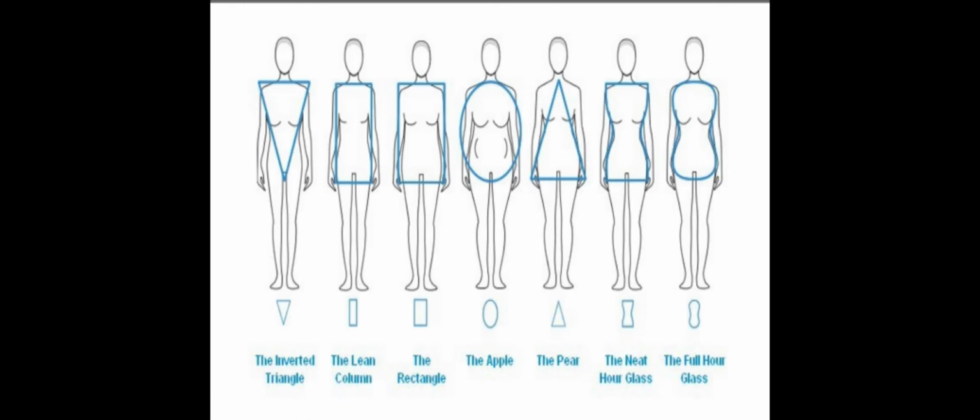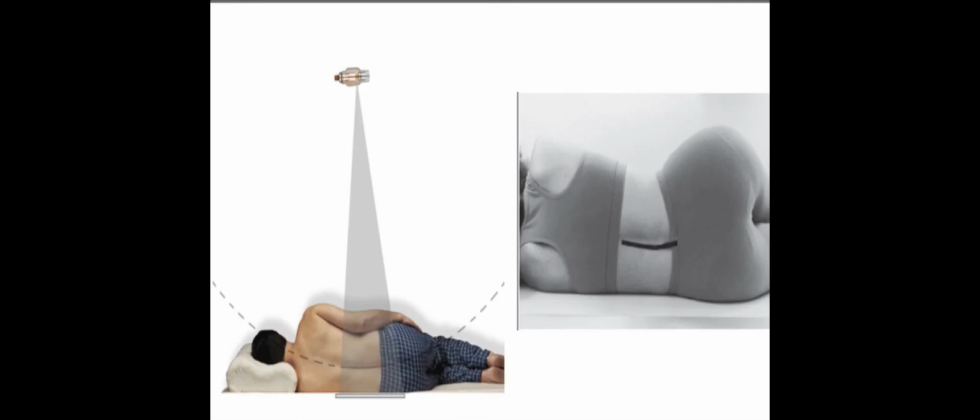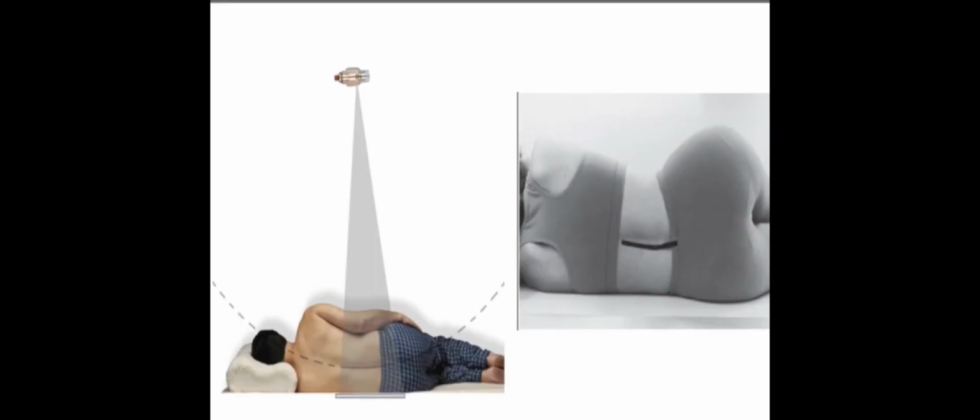All these affect the position of the patient and the alignment of the vertebral column when the patient lies. So when the patient lies this way, the divergent X-ray beam will not align parallel with the intervertebral disc spaces and perpendicular to the vertebral bodies. The resulting image will demonstrate closed intervertebral disc spaces and distorted vertebral bodies. In this one, the disc spaces are not open and the vertebral body looks distorted.